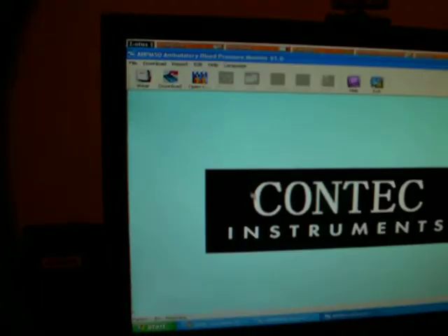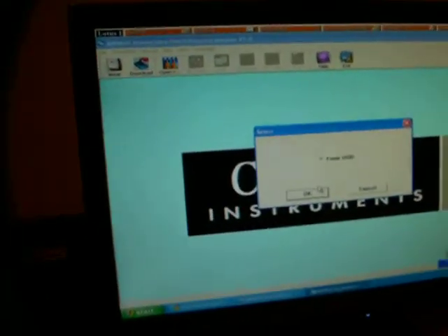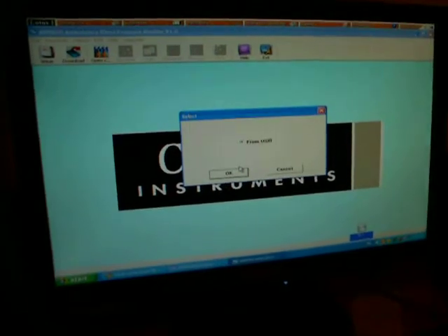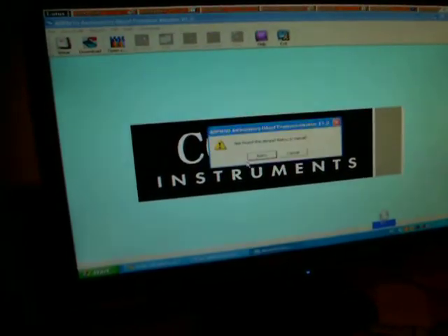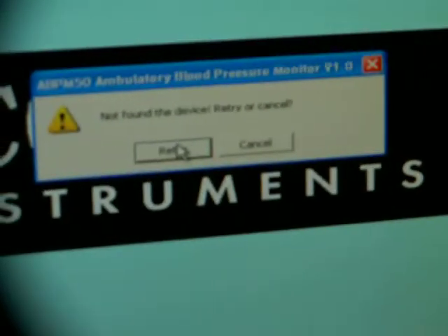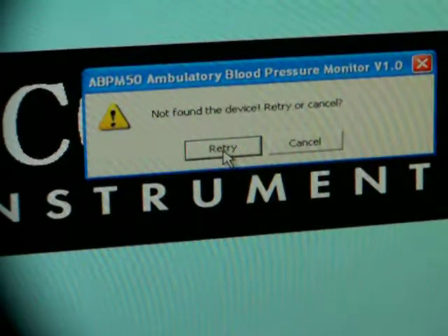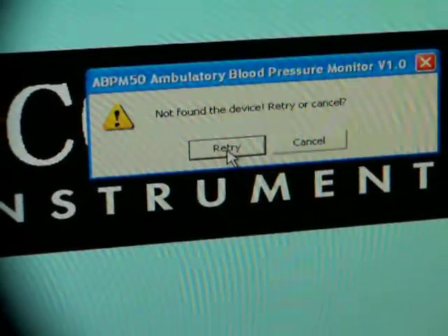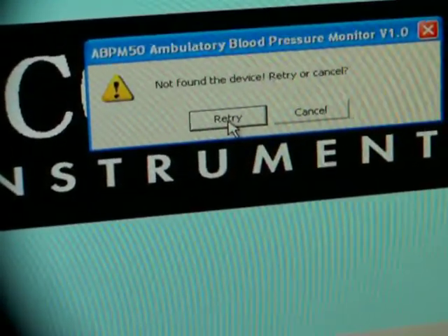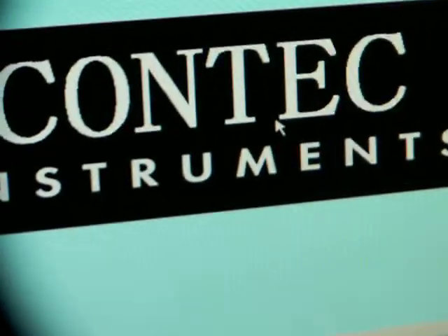You can see the records. Now I will go to contact, and I will go to download — from USB. And this is what it says. So I will retry. Nothing happening there, so I will press cancel.